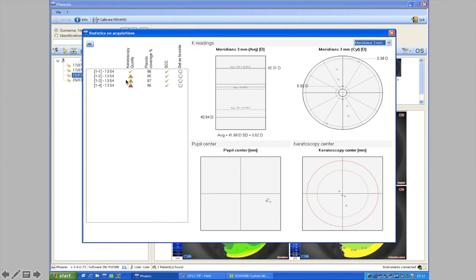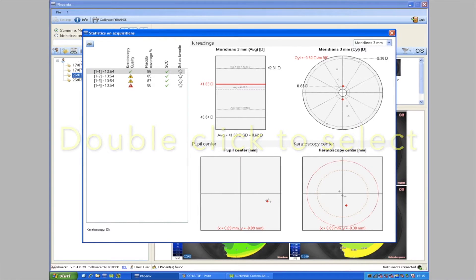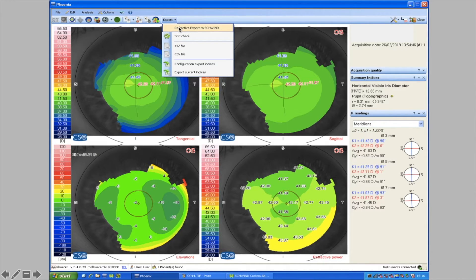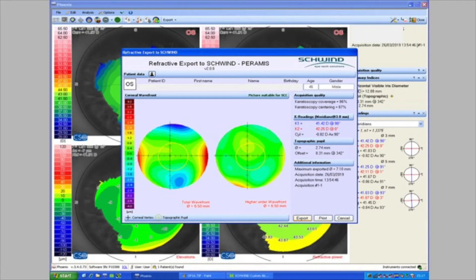You can type in K values manually if topography scans are difficult to export — for example if there's a shadow from the nose and the acquisition diameter is too small. Topography also gives you pupil offset from the corneal vertex, which is useful in wavefront compensated treatments but less relevant for wavefront guided. We right-click here, drop out the dialog box, look at the scan sequence and quality indicators, choose the best scan, and send it through by pressing 'Refractive Export to Schwind'. You can click 'Interpolate Rings' to get a slightly larger diameter before sending through, then export the summary panel and archive it ready for importing into the treatment planning software.